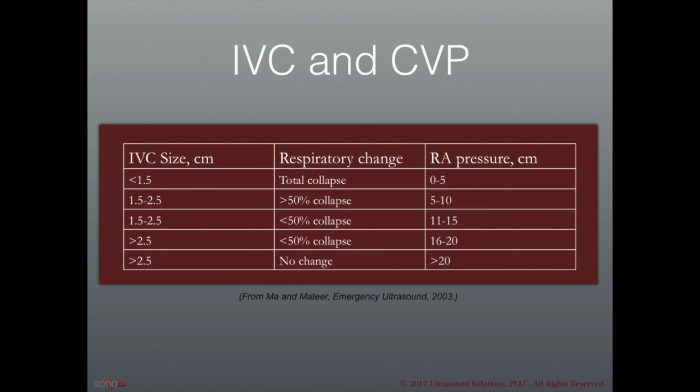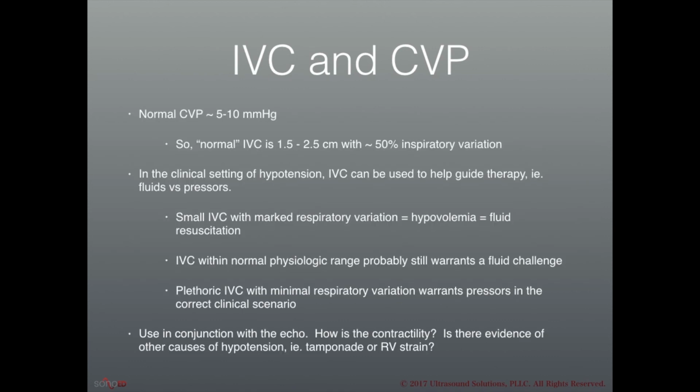And I kind of think of the IVC as somewhat of, when you put your finger in the wind and you're just trying to figure out roughly which way the wind is blowing, but you're not being all that precise. That's somewhat of what the IVC is doing, and I don't find it to be near as specific as this chart suggests. What do we do with that data?